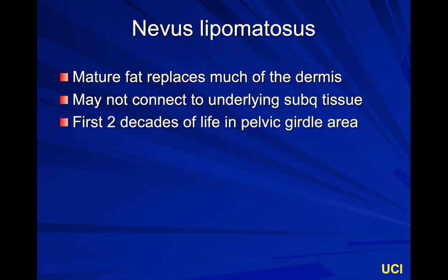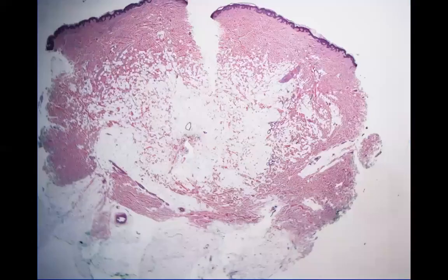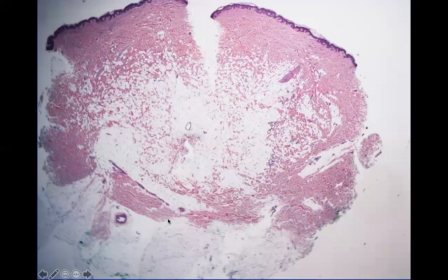Nevus lipomatosis is a fat tumor where fat replaces much of the dermis — very superficial fat that may not connect to the underlying subcutaneous tissue. To truly diagnose it, you need a clinical history: it occurs in the first two decades of life in the pelvic girdle area. In middle-aged patients, the differential is nevus lipomatosis versus a superficial lipoma versus a fatty tag — we can't distinguish without clinical history. Here you can see mature adipocytes up in the dermis, with subcutaneous tissue below.